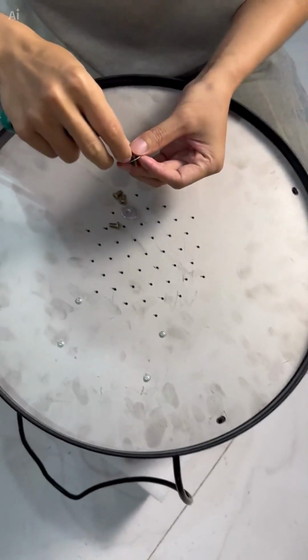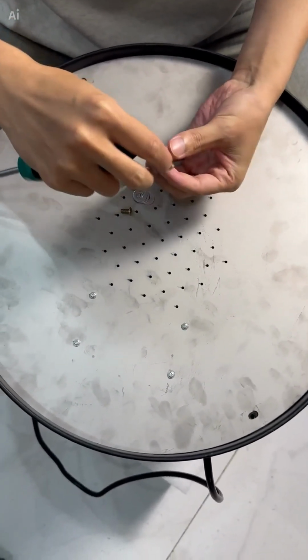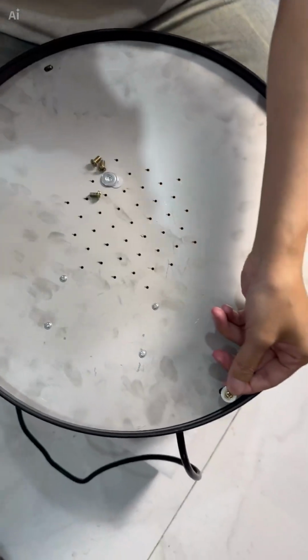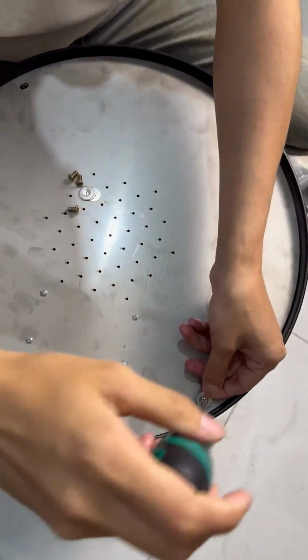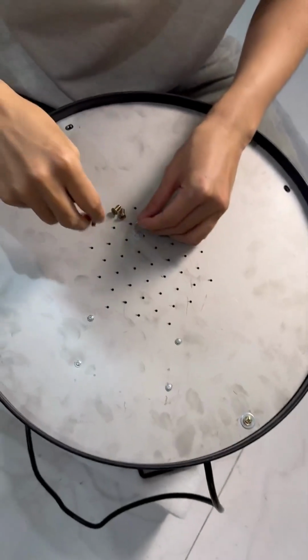Okay, when we are fastening the screws, we need to pay attention to using one screw for one washer to secure it. Let's fasten them one by one. Now, the second one.